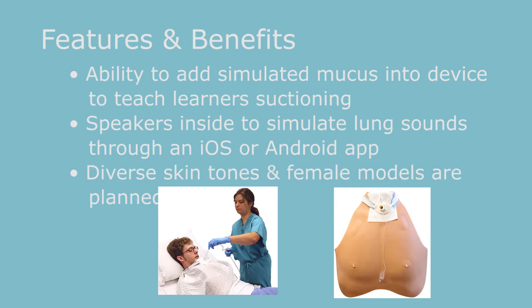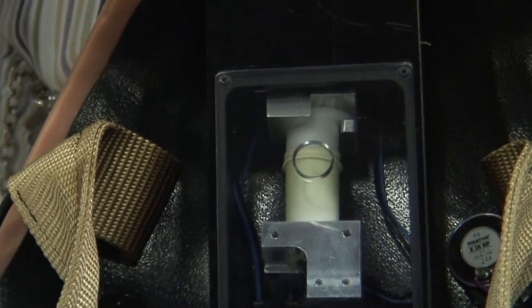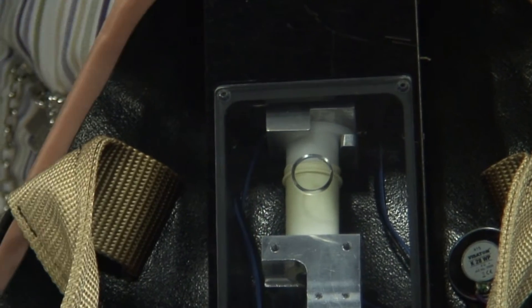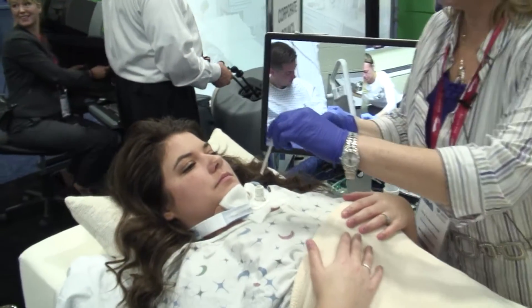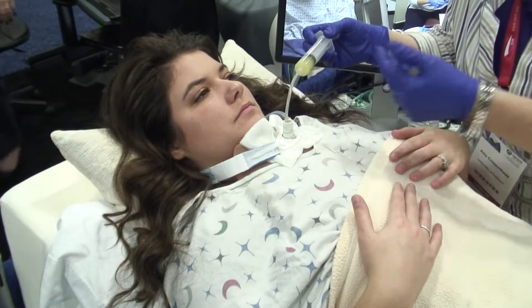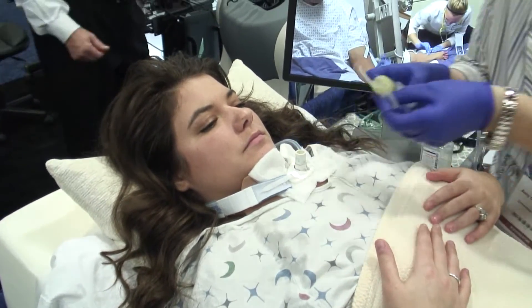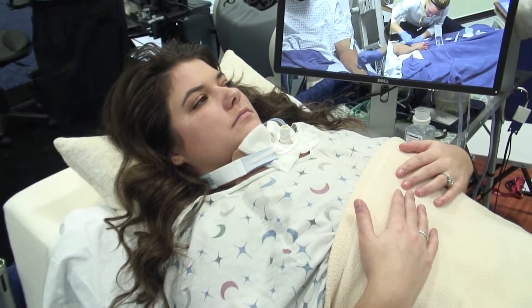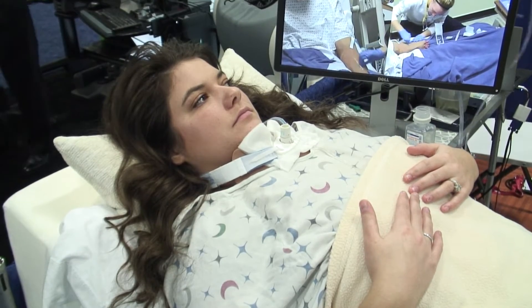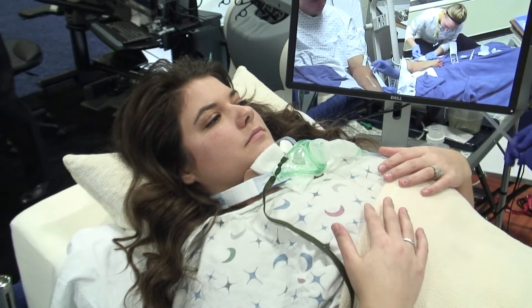This white piece here is a reservoir that houses the mucus, so you can actually insert simulated mucus into the device and do suctioning on the patient — actually knowing what it feels like to suction a patient, hear the sounds, and know what suctioning until clear is. You can insert the mucus just into the outer part of the tracheostomy device, about three to five milliliters, then put her trach collar on and get set up for suctioning.